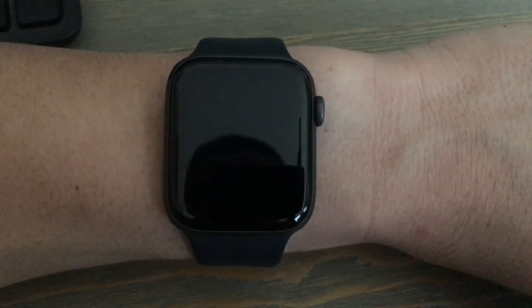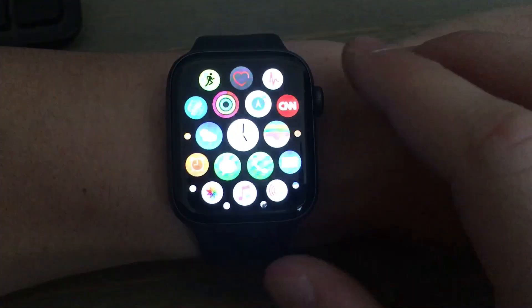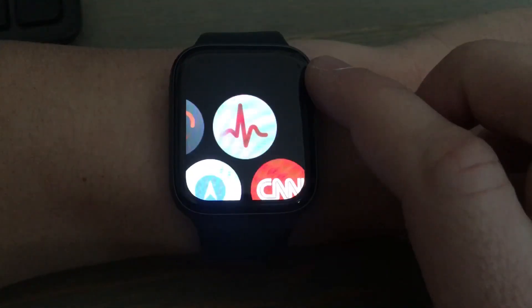Hey guys, welcome back to Random Things. In this video I'll be showing you how to do the EKG or ECG inside the Apple Watch Series 4. First, you just want to click the side button to go to your apps, and then this is the app you want to search for — this one right here.